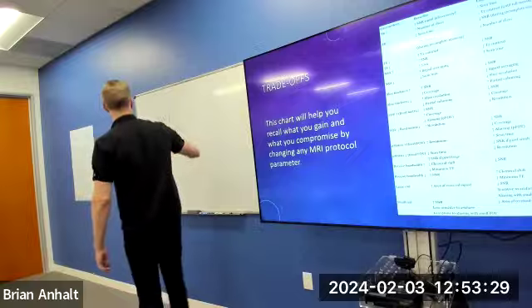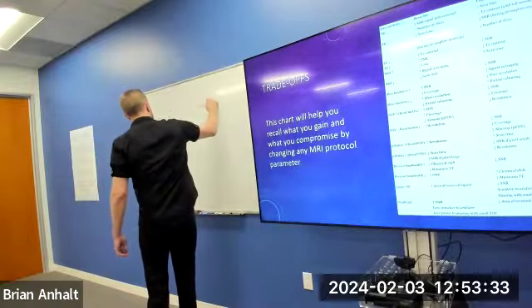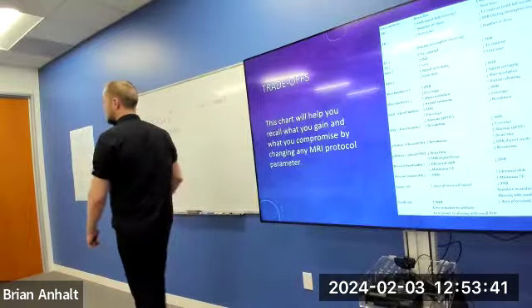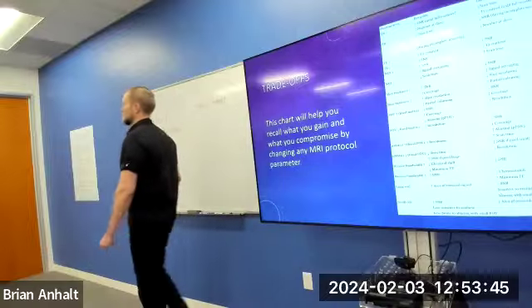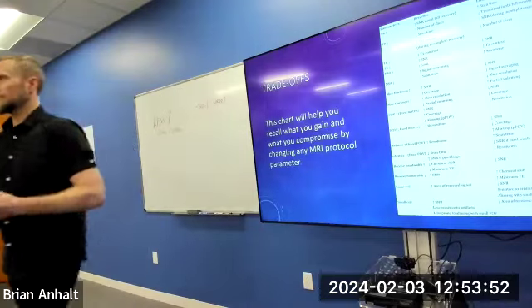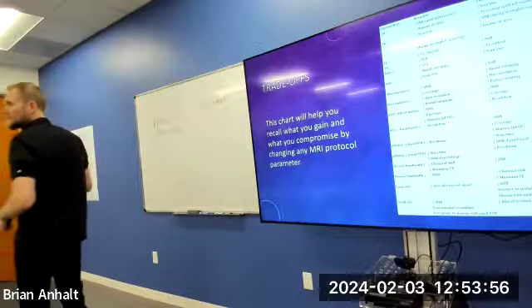Anything? SNR went down. Why? Because our noise went up, right? Anything happen to scan time? Not directly. Did anything happen to resolution? No. But remember, we have artifacts and other things in there too.